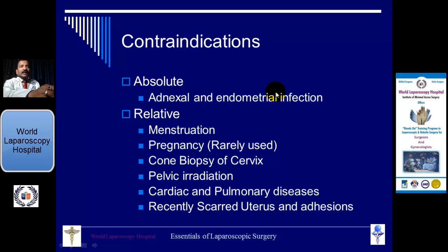Another relative contraindication: in menstruation you should not do it. Why should hysteroscopy not be done in menstruation? Pardon? Endometriosis. One will be endometriosis. All the shed endometrium can go.